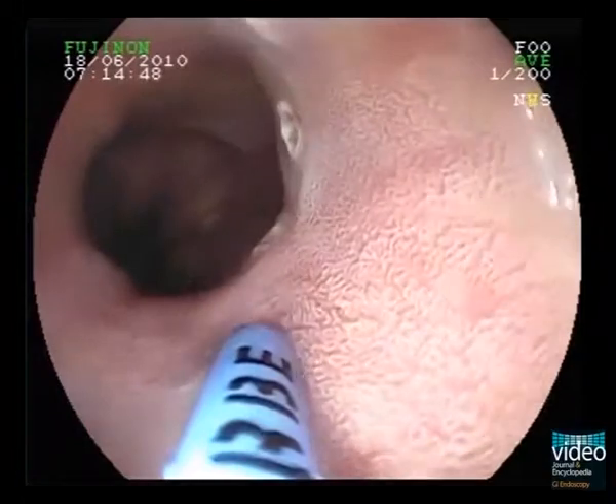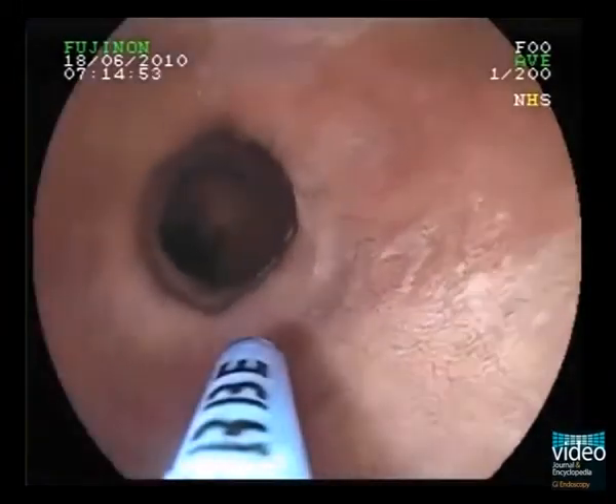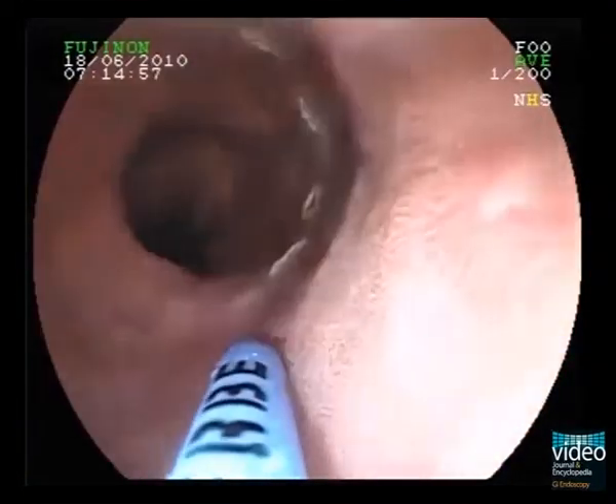We usually perform marking around the lesion with about 5 mm distance to the visible borders. In this case, we used argon plasma coagulation with the VIO generator and a power setting of 30 watts and effect 2.